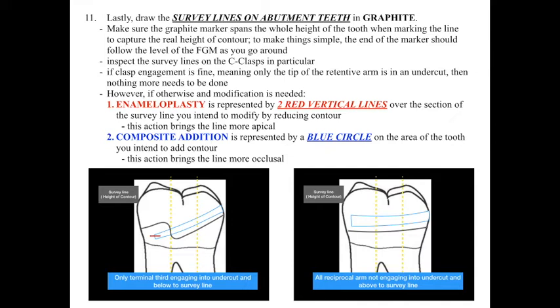Those are the 2 new things I mentioned today. In the past, I haven't mentioned them because for most I-bar locations, it's not really necessary to modify the tooth. However, when you design a circumferential clasp or a ring clasp, then you might need it. So, for the ideal survey line for the retentive arm, remember you just divide it into thirds.